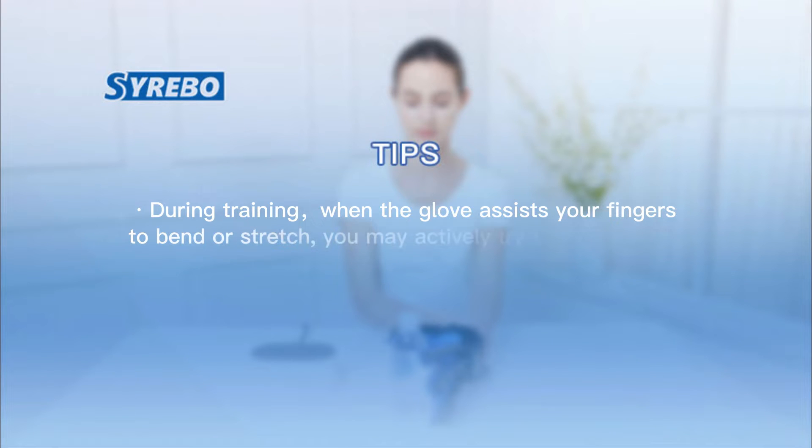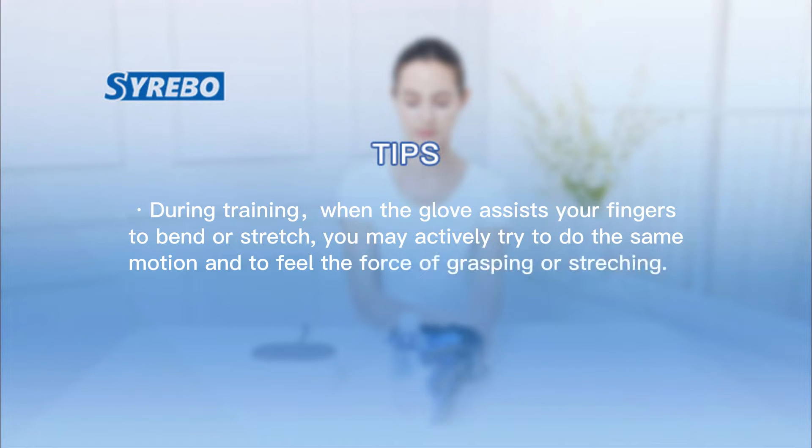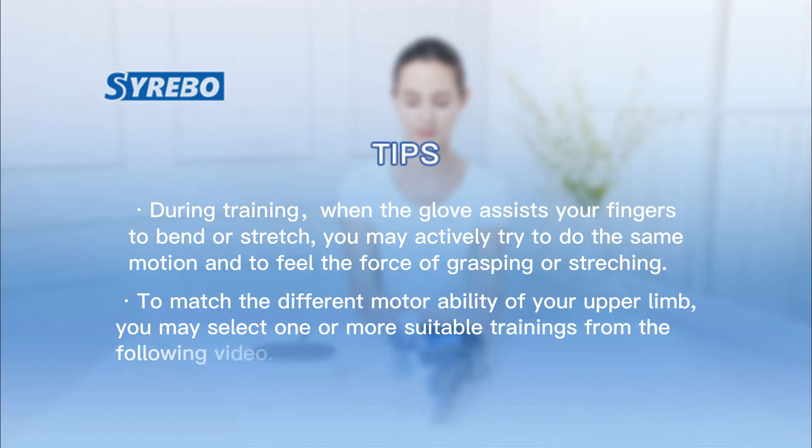Tips: During training, when the glove assists your fingers to bend or stretch, you may actively try to do the same motion and feel the force of grasping or stretching. To match the different motor ability of your upper limb, you may select one or more suitable trainings from the following video.